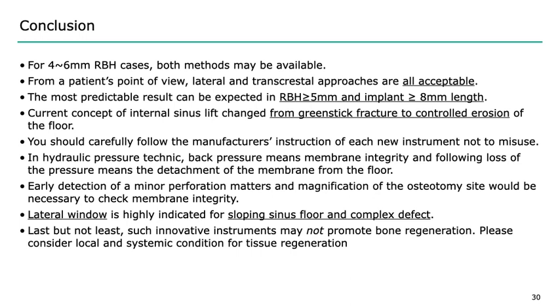So let me conclude my talk. So for 4 to 6 millimeter residual bony height cases, both methods may be available. So you can go for transcrestal and you can also go for a lateral window. From a patient point of view, lateral and transcrestal approaches are all acceptable. The most predictable result can be expected in residual bony height not less than 5 millimeter and dental implant should be 8 millimeter or longer.